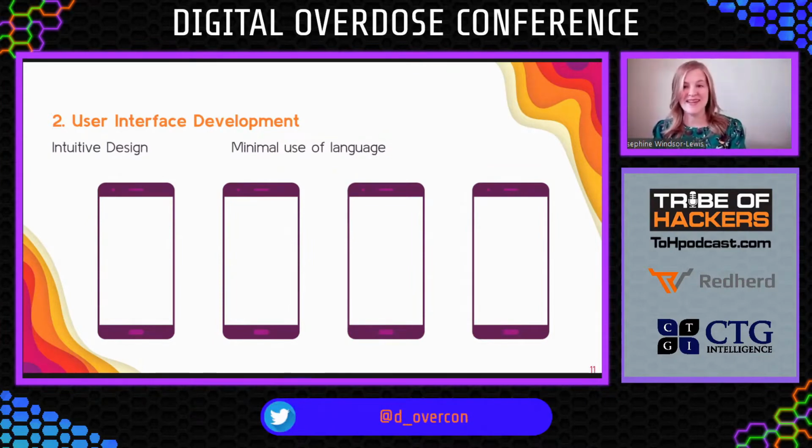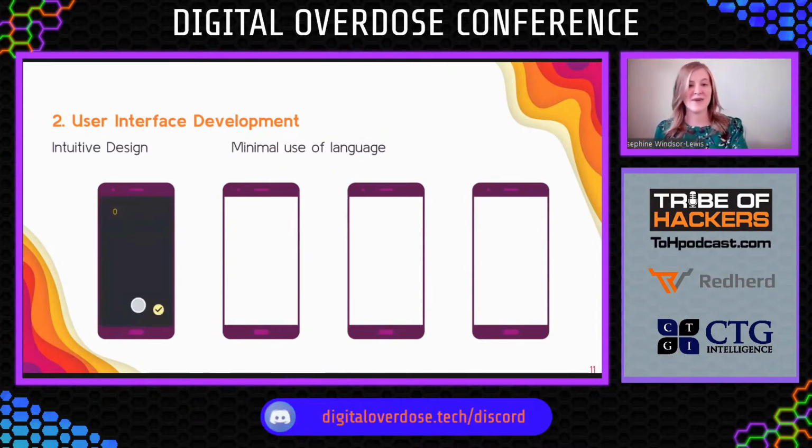So we broke the app down into 4 main stages. First, the camera. This is a full screen display of what you're looking at through the camera. So you can just focus on centering the image, getting the right bits in. It's got a small counter at the top. You can see it's currently on 0. That clicks up every time you take an image. So you can see how many you've taken in that session.